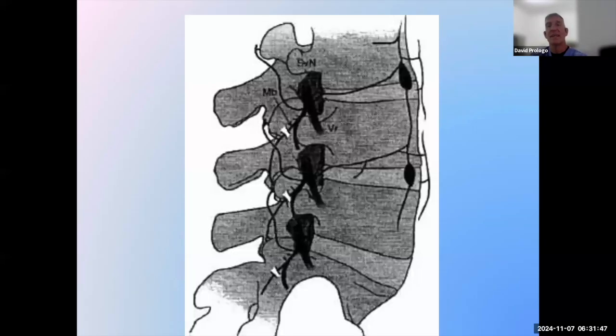But here's the important target. So if we're using facet pain as our example of what we're doing here, we have done the following. We've listened to the patient. We have found a radiological correlate in facet hypertrophy. Now, the next step is to identify something on imaging that we can access and do something about.